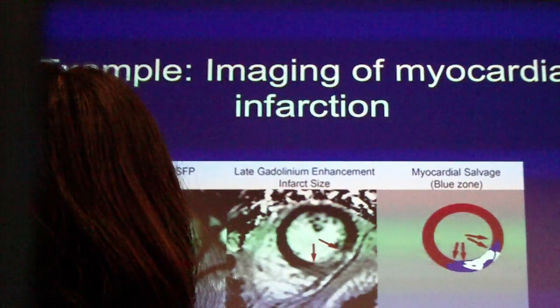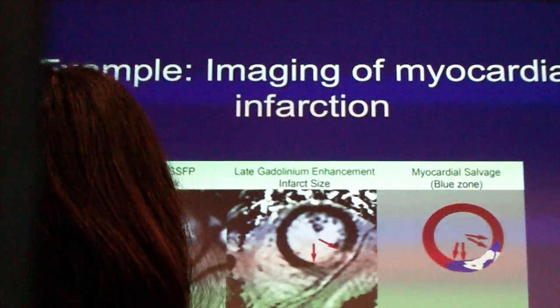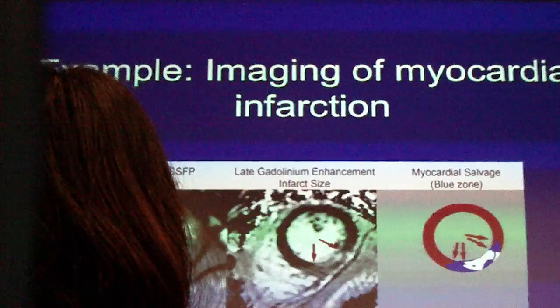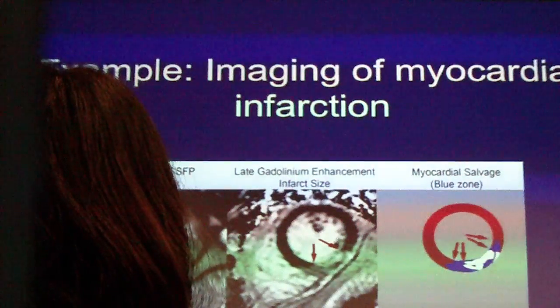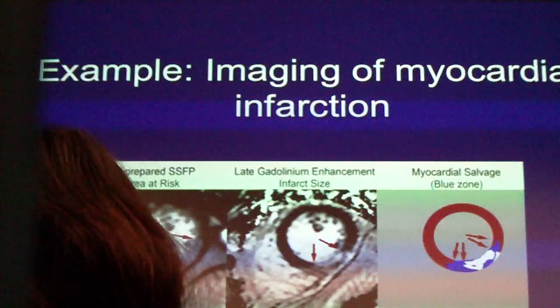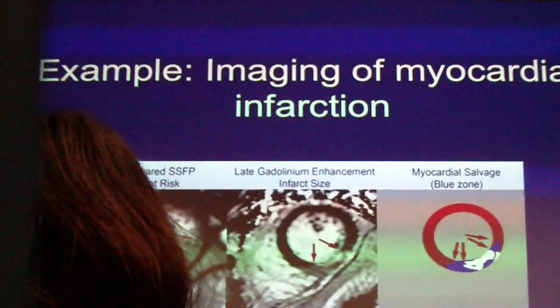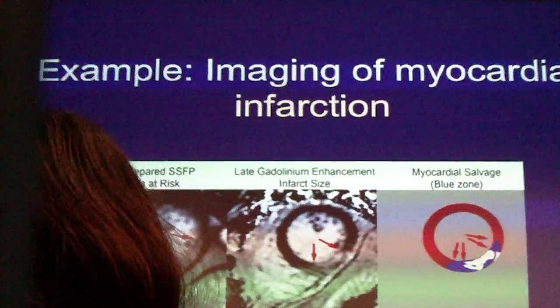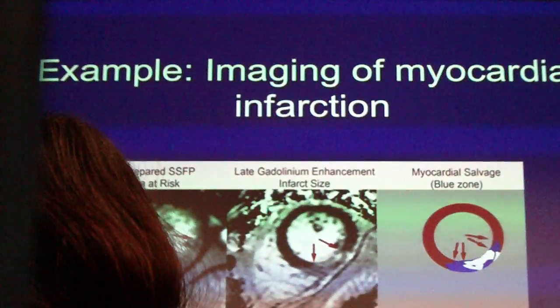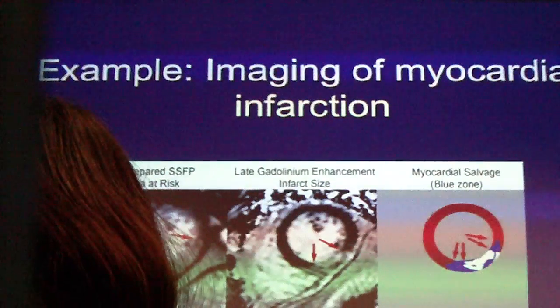You see this is the muscle wall, the thick wall for the left ventricle, where they pump blood through the whole body, and the thinner wall for the right ventricle. And so bright here is the blood inside the heart. And here there was an infarction. You can see it schematically here. Here you have increased intensity in the T2 weighted image. This is blue on this scheme.